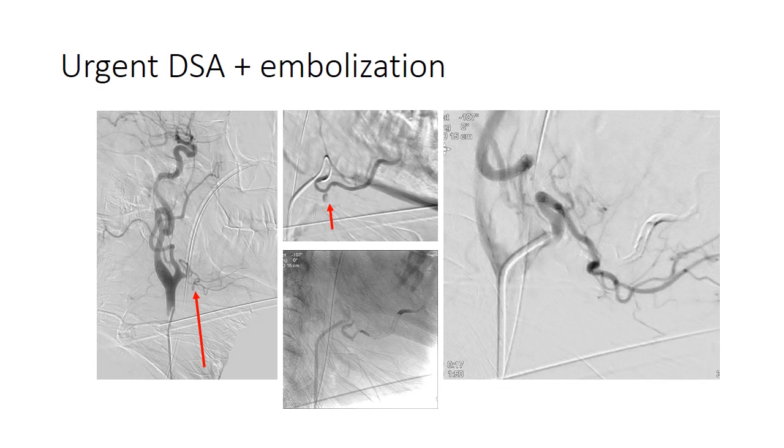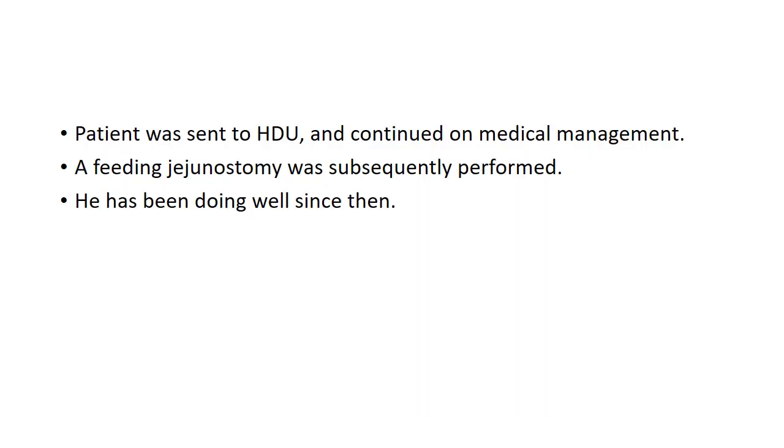Patient was taken up for urgent DSA, which revealed the pseudoaneurysm from lingual artery trunk. After superselective microcatheterization, glue embolization was done with lipiodol mixture with successful parent vessel occlusion. Patient was sent to HDU, and continued on medical management. A feeding jejunostomy was subsequently performed. He has been doing well since then.